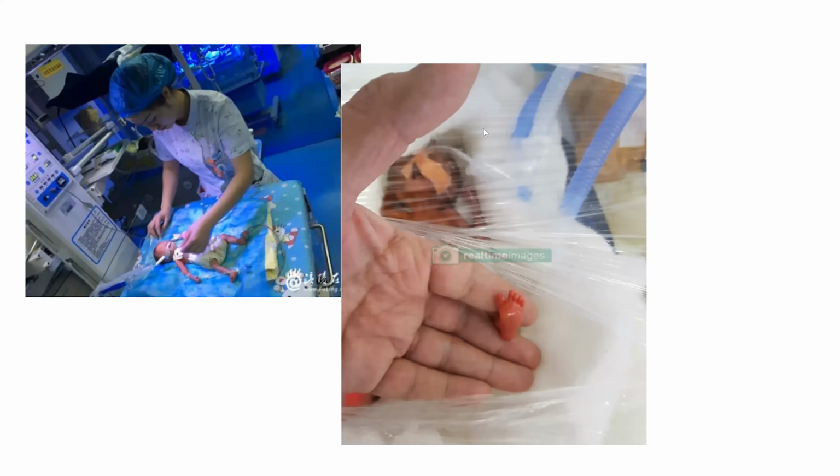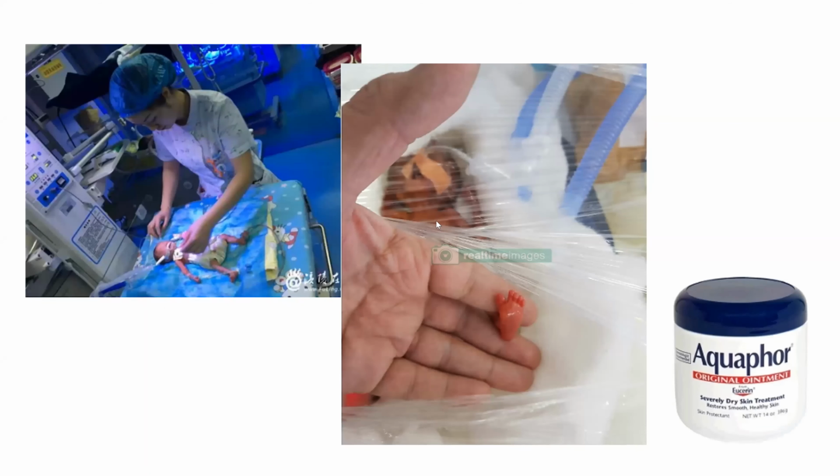And you can see here, this is a kid who's being nursed in an open warmer, intubated, very tiny baby. This was a tiny baby I found online from Japan, where 22-weekers are commonplace in the NICU. We would bring the sidewalls up and strap saran across these babies. Sometimes we still do it, even for cooling babies. We would just wrap their extremities. We literally had saran wrap in the clean utility room and we would go get it. And then came along Aquaphor.